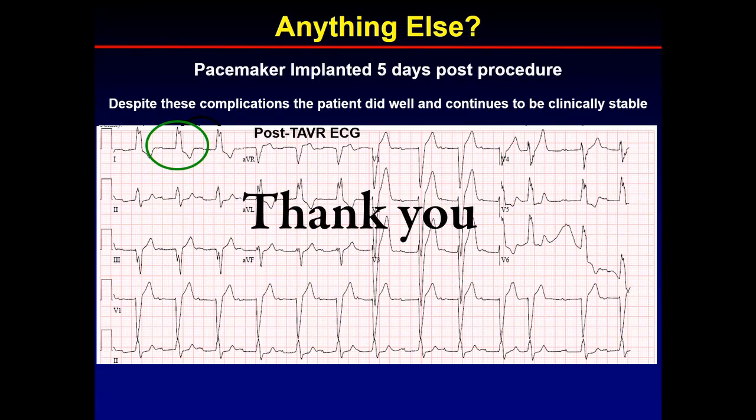Thank you for the excellent overview. I think highlighting the conduction disturbance issue is another example of the role of CT in TAVR, understanding patient-specific anatomy. Beautiful paper from Ashraf Hamdan, published a couple of years ago in JACC Intervention, looking at the membranous septal length to understand personalized risk of compression of the bundle of His and therefore new onset conduction disturbance.